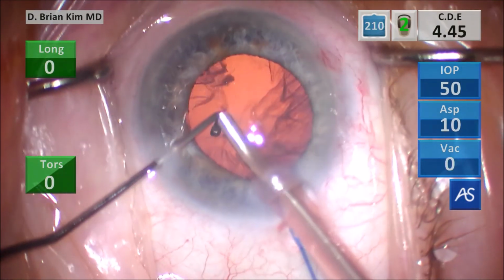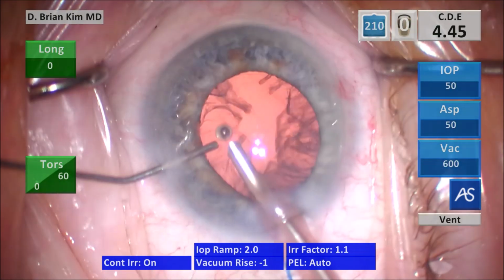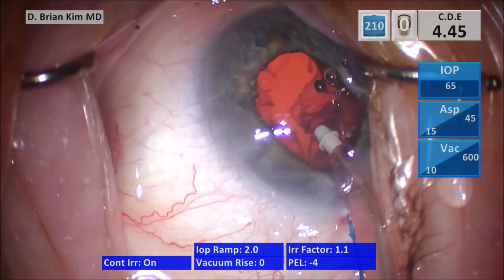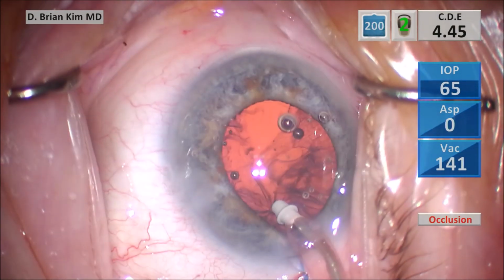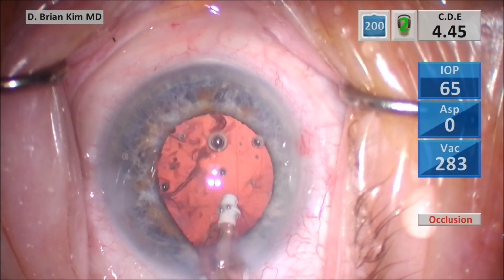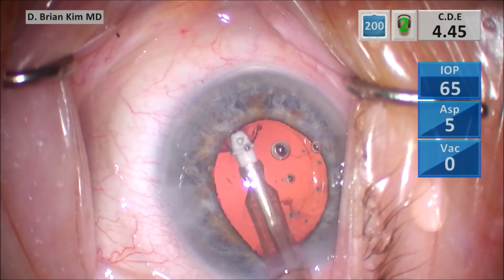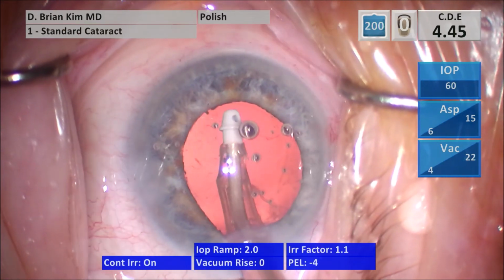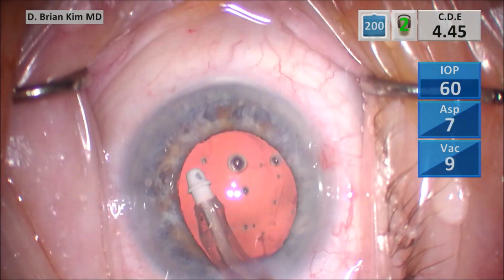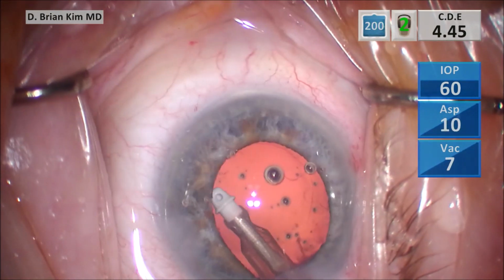So I take the chopper out, push BSS in, take the phaco tip out, and I go in with the I/A handpiece. Start subincisionally removing the cortical material, peeling from anterior to posterior, gently teasing it up and removing it, going around circumferentially. Switching to polish mode, polishing under the rhexis edge, making sure I don't grab the capsule in this situation, polishing the posterior capsule. You can see there's some striae in the posterior capsule as I grab it.